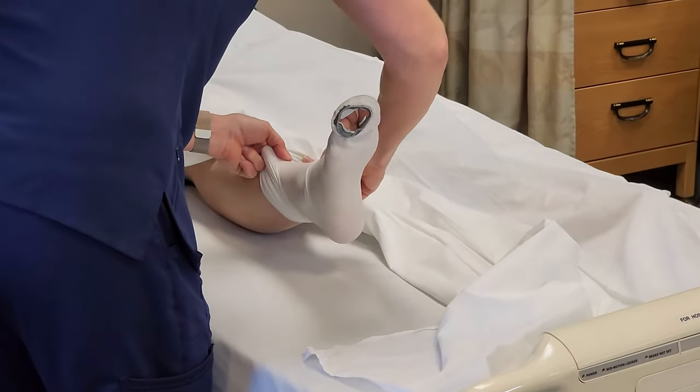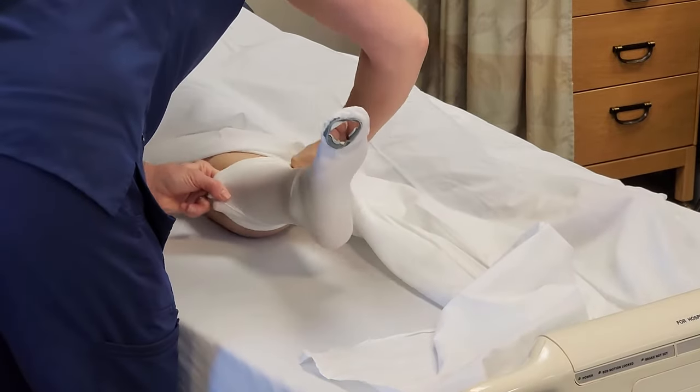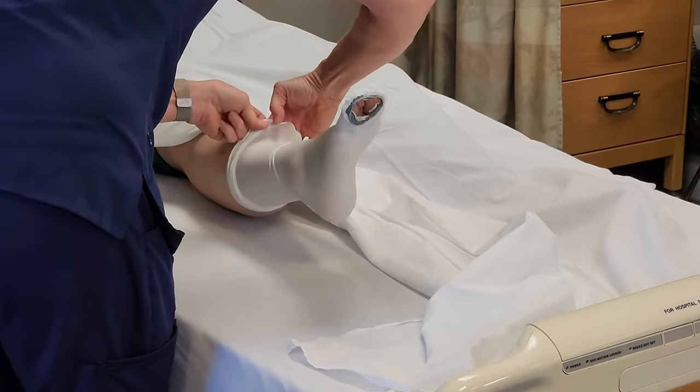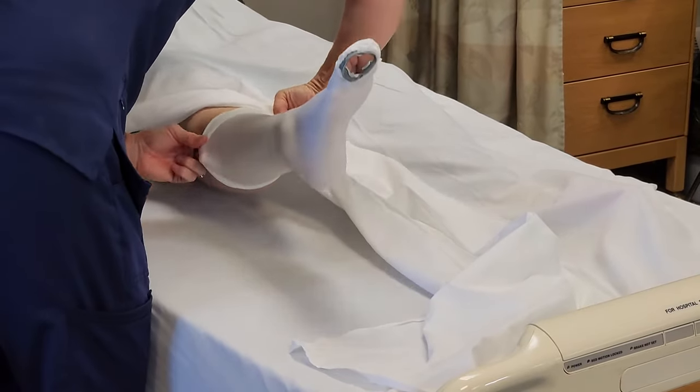I'm going to try to get this as smooth as possible, get all the wrinkles out, and bring that up the rest of her leg.